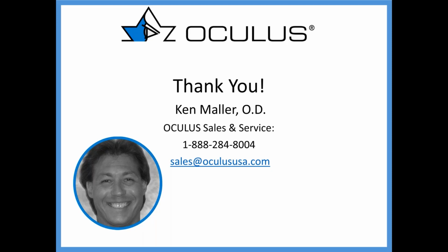Excellent. Here's a common question I see: how flat can you go? Is it 38 diopters? No, it's not 38 diopters. I think that 38 diopters came from the days where you're utilizing pre-made lens designs, and it was found that once you got into 38 diopter corneas, things got very dicey and your treatments were really kind of sloppy and it just didn't work. I've certainly treated and gotten corneas to go considerably flatter than that with Ortho-K with very, very nice clean treatment zones.